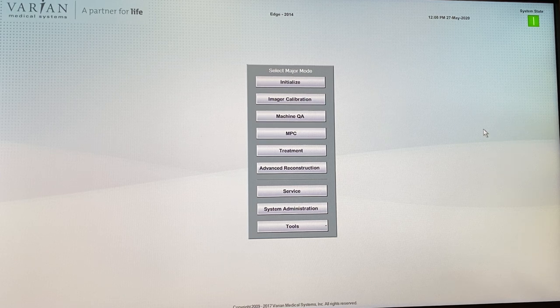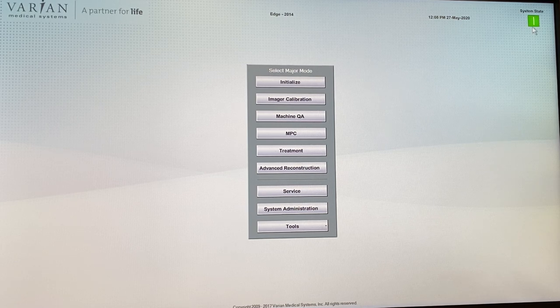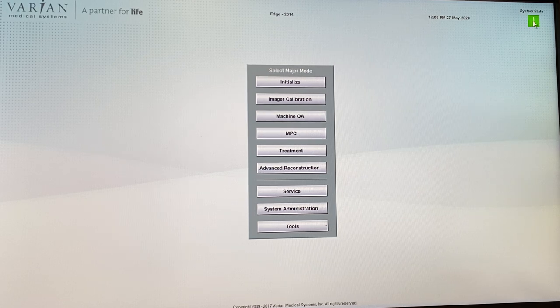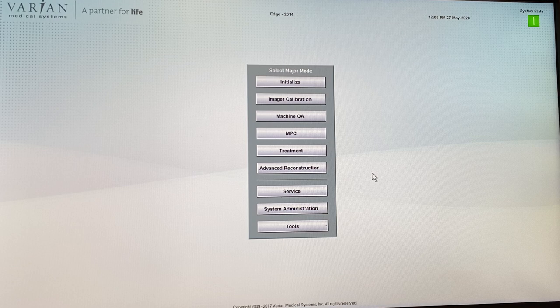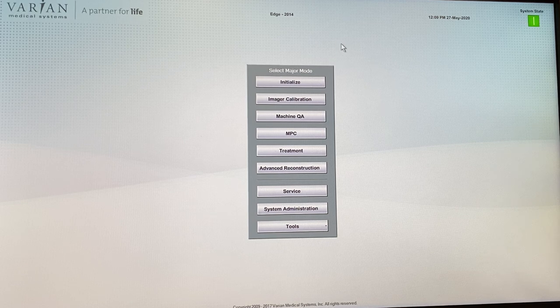This is our Edge machine, but the other machine is pretty much the same. It's currently turned on, which is indicated by the green square in the top right-hand corner. You can turn the machine off using this button, but you can't turn it back on again. If it's orange with a circle, you have to log into treatment mode, machine QA mode, or service mode to turn the machine on.